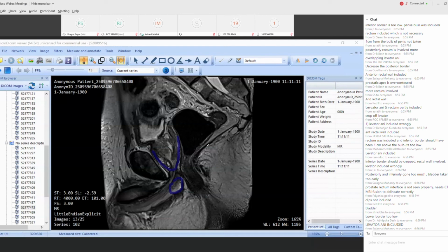Thank you, sir. Quite a few queries regarding IGRT. How do you manage daily bladder and rectal filling associated uncertainties? Do you do multiple CT-based ITVs and then do plan of the day, or do you do multiple margins for small, medium, large ITVs and then do plan of the day? And whether the posterior border can be reduced to spare the rectum in case you're doing daily IGRT?